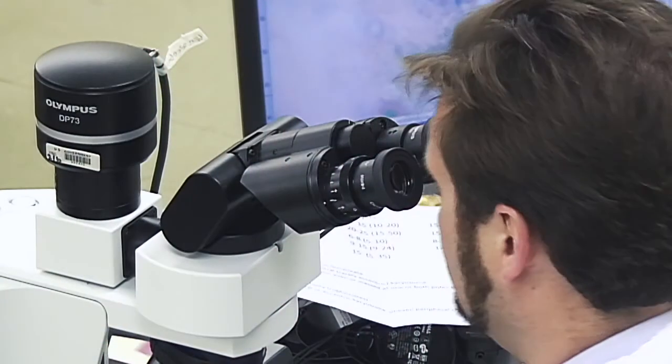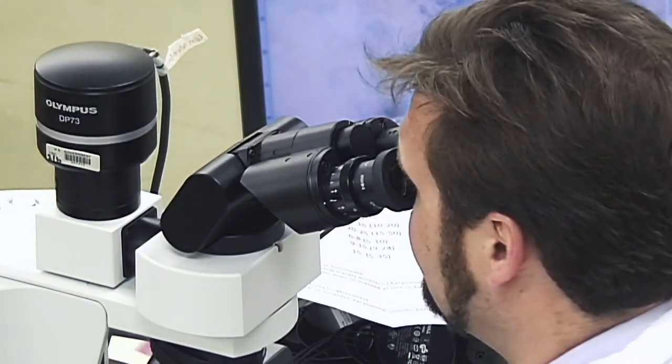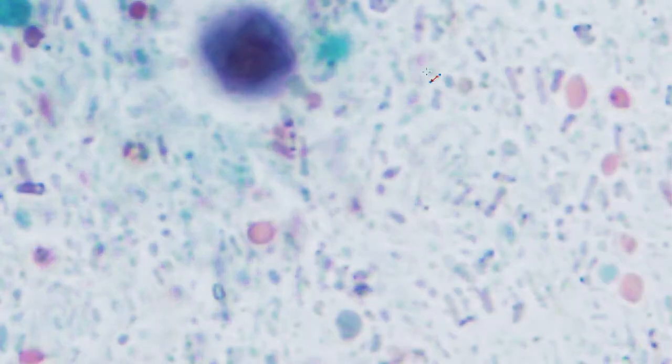Now, as I said, whenever you're trying to work out what something is, there's a lot in this one, but don't forget to measure. Here's another lovely one for you to have a look at. Forgive me, it's a bit difficult sometimes with the microscope trying to get these things in the right spot. Here's a nice example of evenly distributed peripheral chromatin around the edge here.